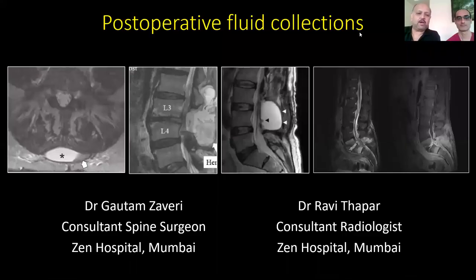Good evening, I am Dr. Gautam Zaveri. And I am Dr. Ravi Thapar, and today we will be discussing the post-operative fluid collections in spine.